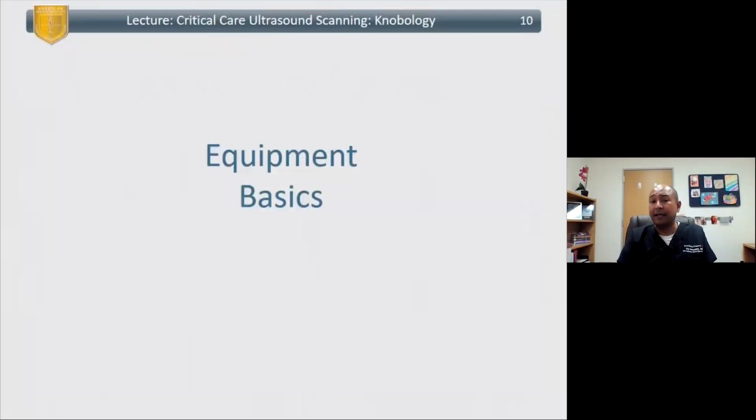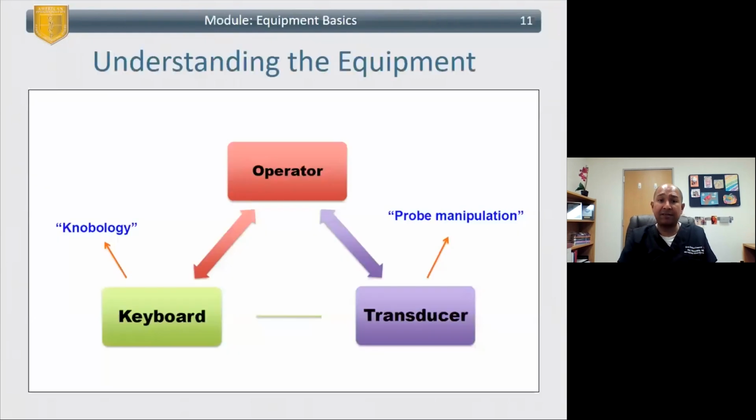So what are going to be some of the basic equipment that you need? To understand the ultrasound, answer questions on the boards, and do well in the hospital, there are three things that all need to interact together. Number one, you've got to be a good operator. And how do you become a better operator?